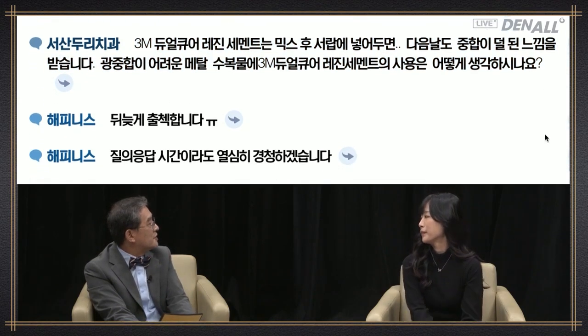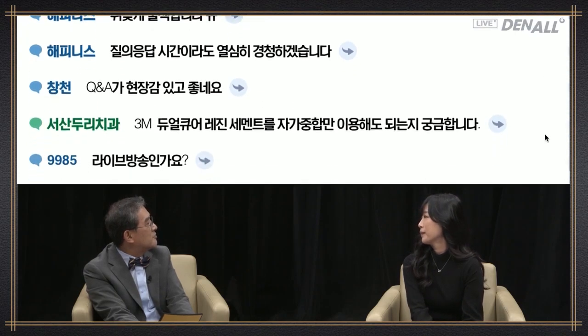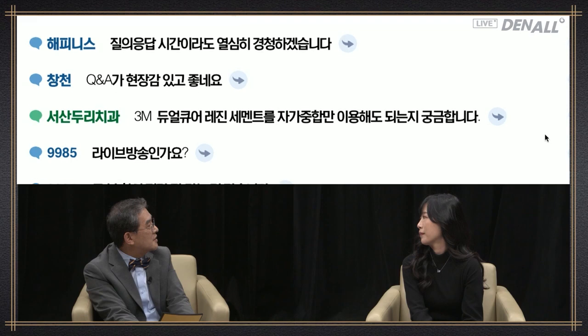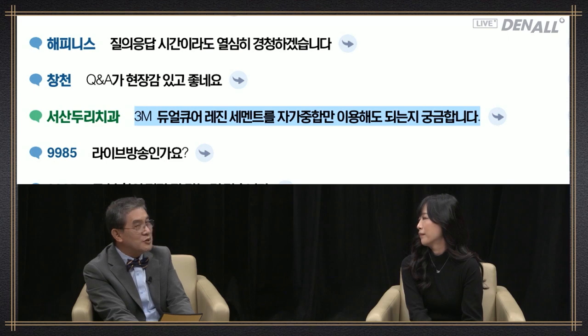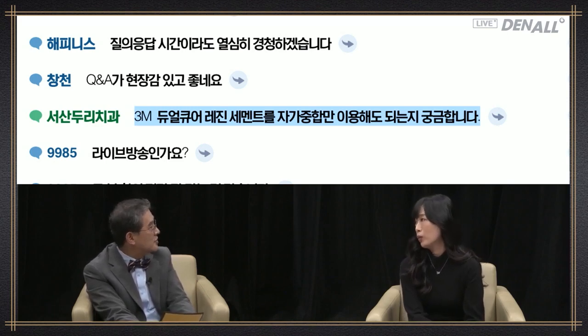ID Chang Chun: Listening to Q&A makes me feel like I'm actually there. Can I only do self-curing with 3M dual cure resin cement? Not just self-curing, but you need to do light curing a little bit to improve the polymerization rate and in removing excess cement.